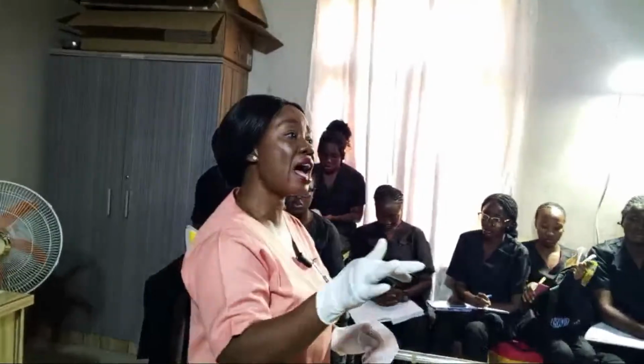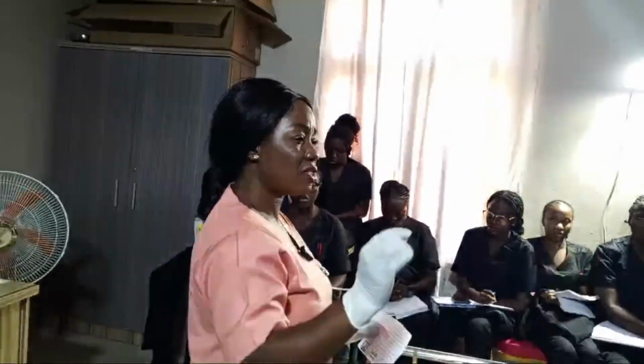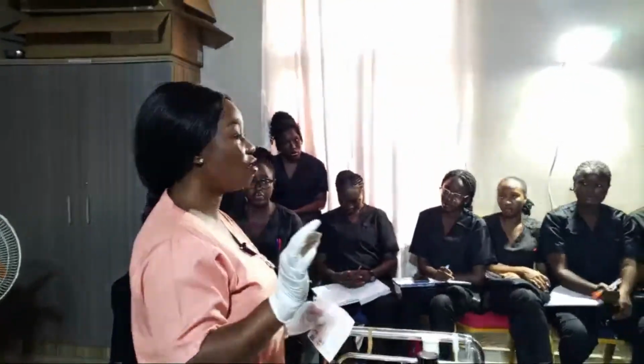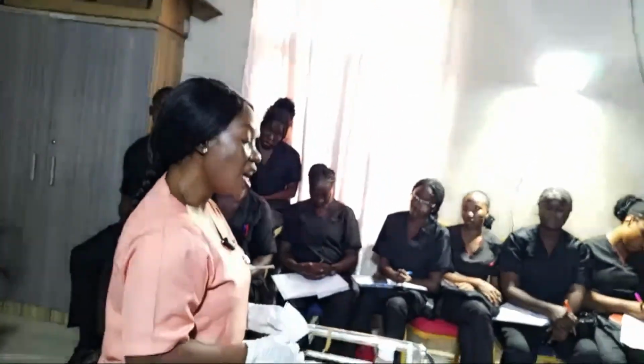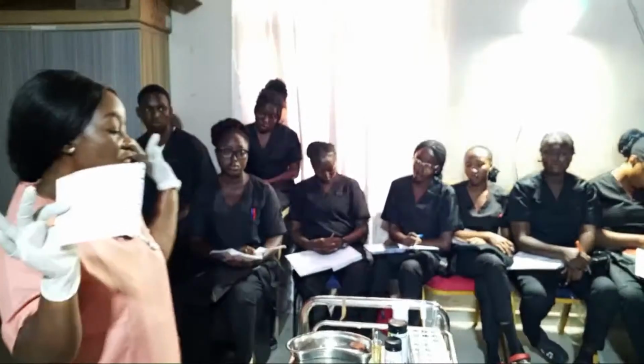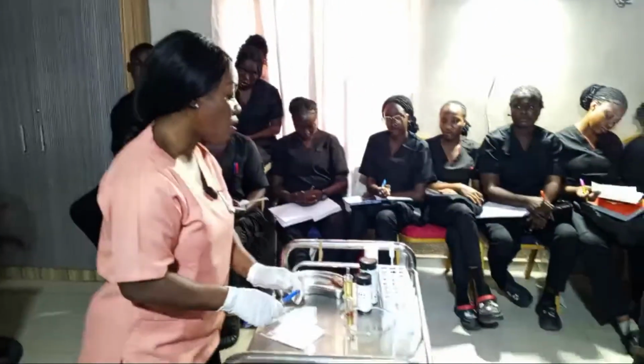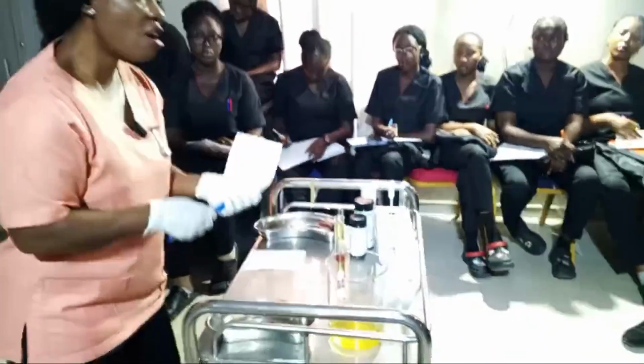Depending on the concentration, if the urine is highly concentrated, the specific gravity will rise. If the urine is not highly concentrated, you will see the specific gravity will just drop, right? So now I've noted, and I didn't touch any urine, right? So I can also bring out my pen again and continue recording.